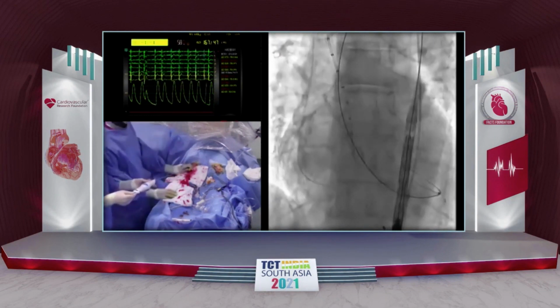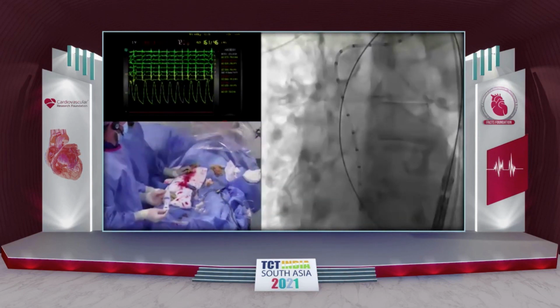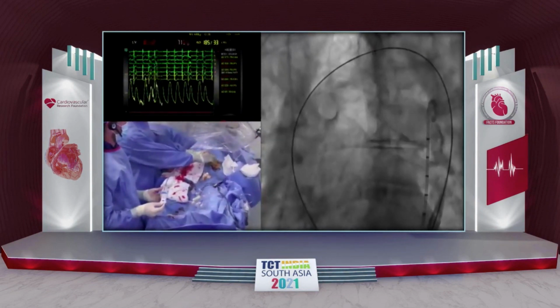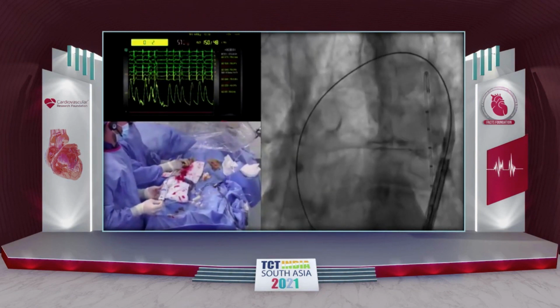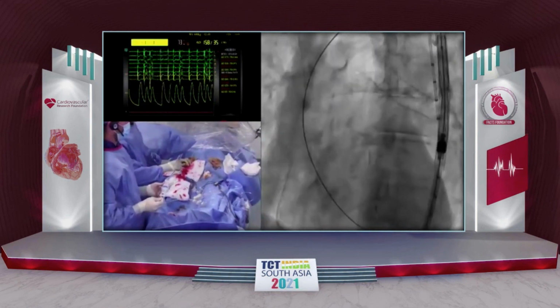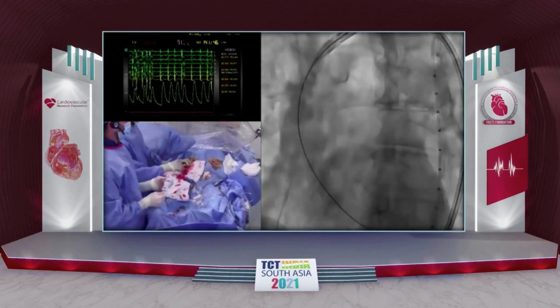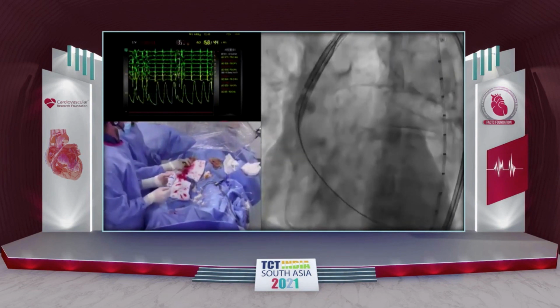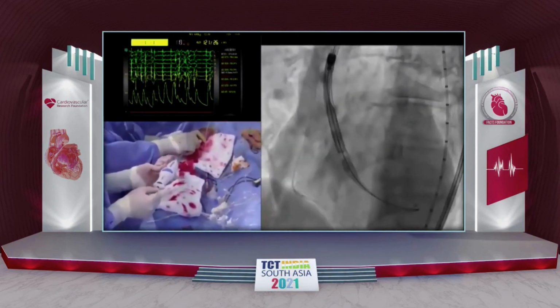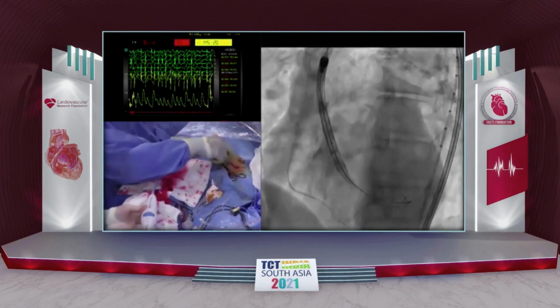Okay, let's see the arch a bit, off mag a bit. Maybe go to LAO 15. Yeah, I'll do. So normally we do TAVI in our hybrid room, but because of the transmission and also we have a GA list going on in the hybrid room, we have now gone to the original room where we started doing TAVIs, which is room 4. It's as big as the hybrid room, but the imaging facility is not designed for, okay, that's good. So store that.